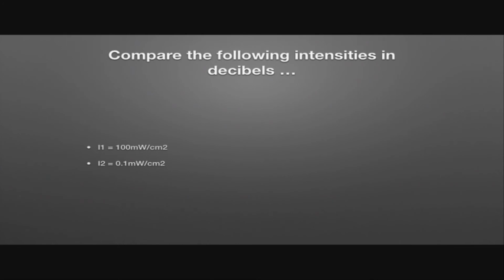So if you have intensity 1, which is at 100 milliwatts per centimetre squared, as opposed to the second intensity, which is 0.1 of a milliwatt per centimetre squared, we can see that we've dropped about 1,000th. Okay, so the ratio is 1 to 1,000. That is a 30 decibel drop.